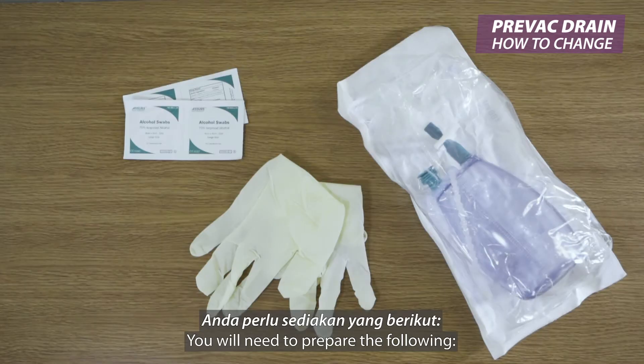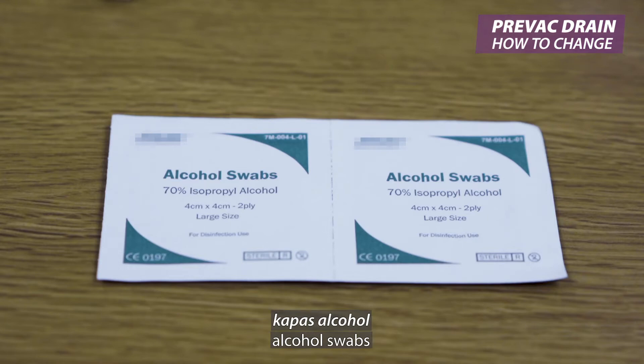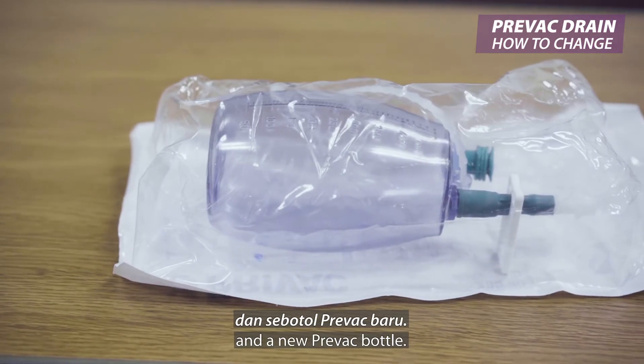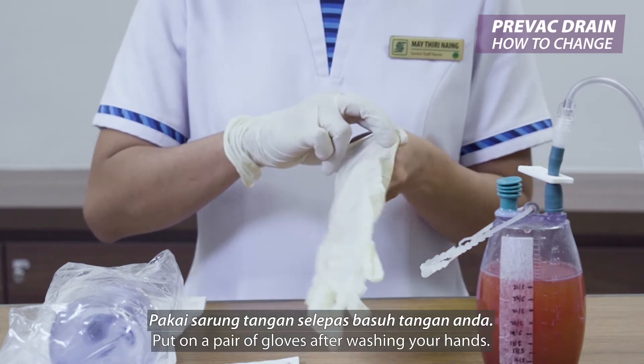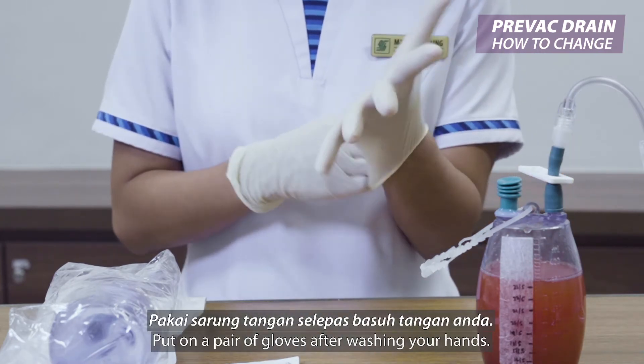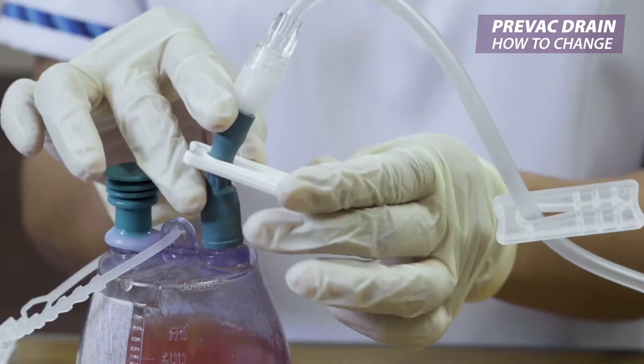You will need to prepare the following: gloves, alcohol swabs, and a new Prevec bottle. Put on a pair of gloves after washing your hands. Get these items ready.